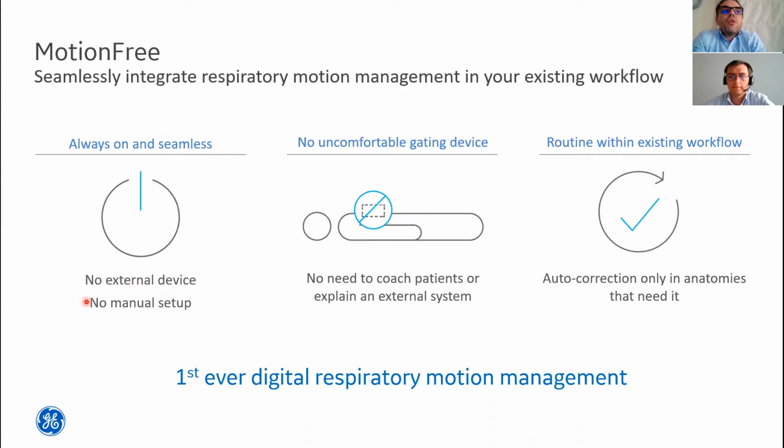In motion correction techniques with the use of an external device, there is a procedure that has to be followed before the scan starts. There is a procedure where the technologist has to initiate the camera and synchronize it with the protocol. This is sometimes complex.